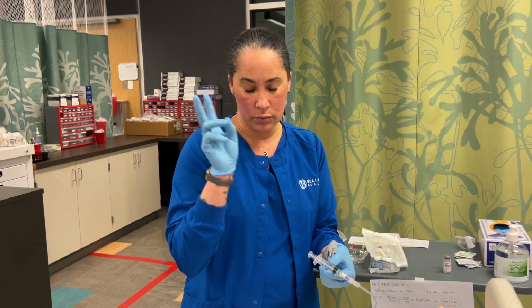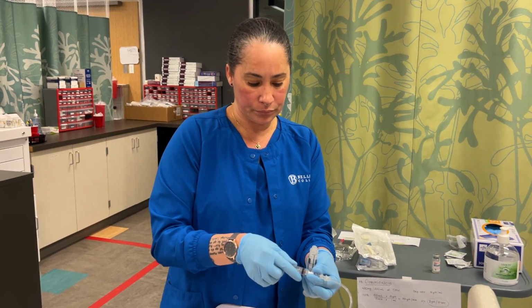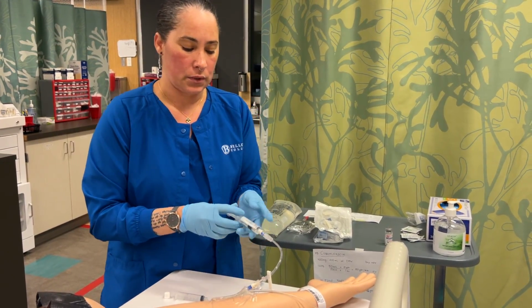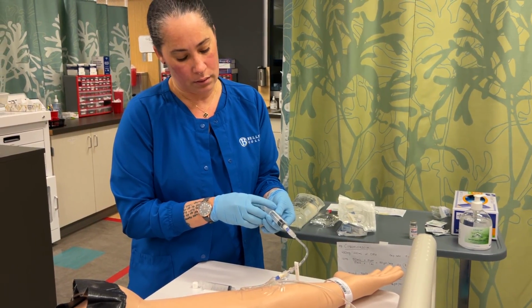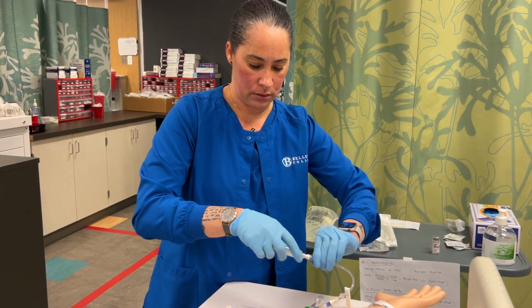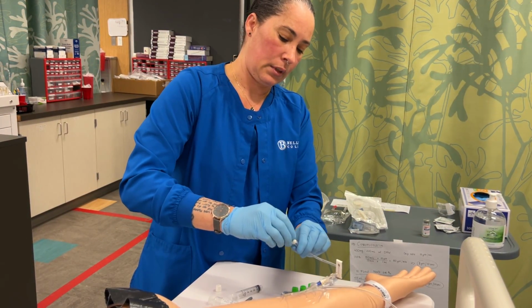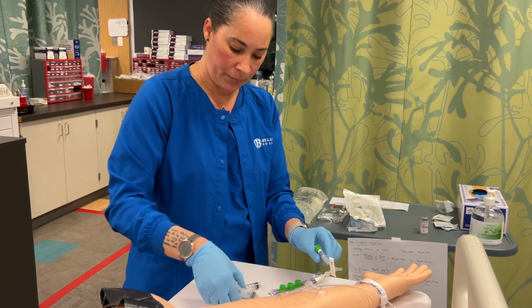For the sake of time, we're going to say it's been 2 minutes, so the med is in, the patient's feeling fine, and so we are going to flush the rest of this. All right, so we're going to flush this. Okay, perfect. All right, so we are going to clamp this and cap it. And these have alcohol in them, so it's sanitary and sterile.